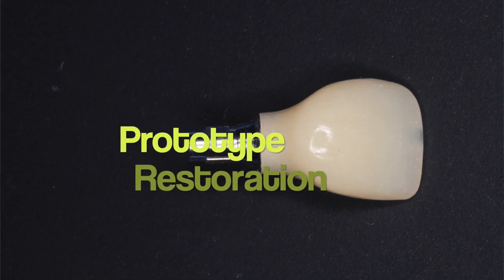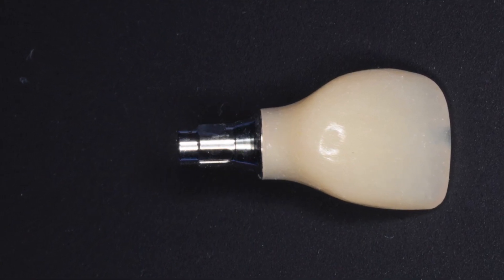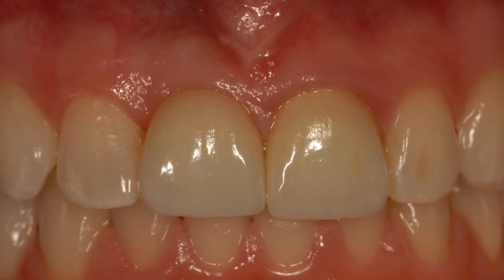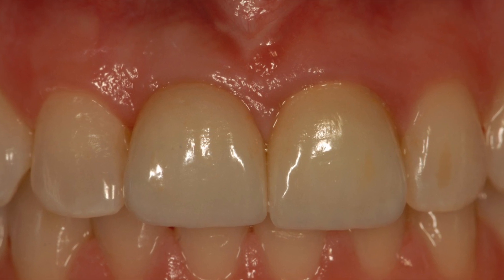The next part is a provisional restoration, also referred to as a prototype restoration, which is made of temporary material and mimics the design of the final restoration. It's highly recommended for implants in the smile zone but can be used on any implant before proceeding to the final restoration. The prototype restoration helps to set the gum line, its aesthetics, and also design the bite before the final teeth are made. It also gives patients an opportunity to provide feedback and make any modifications as necessary.